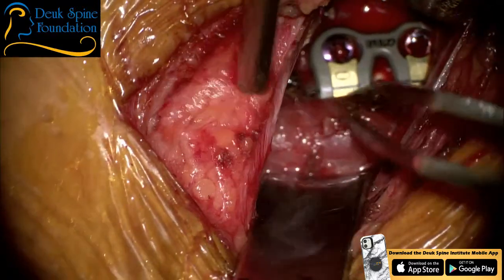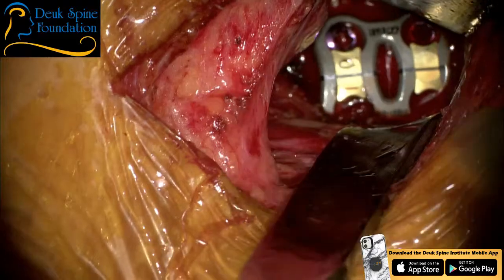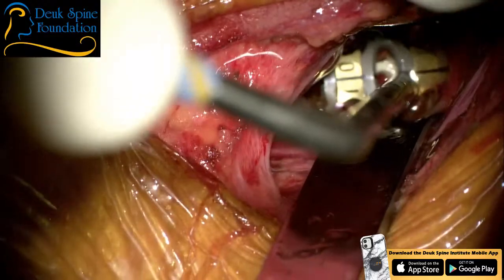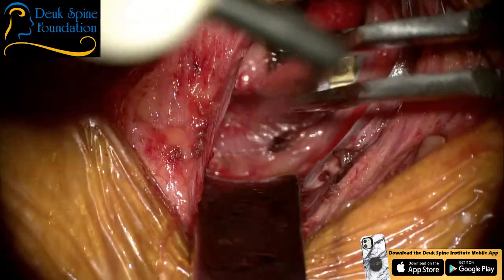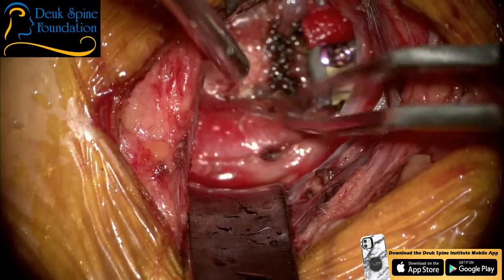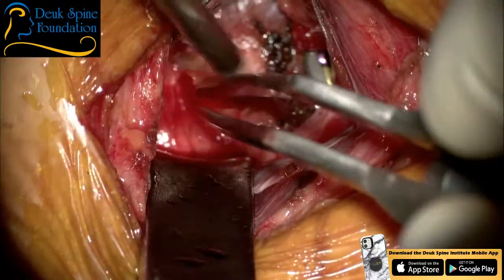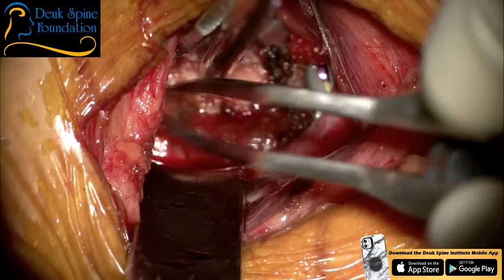He needs to retract. He needs to move the sucker to the other side. He's bumping up against my hand. Okay. Irrigation. Show me where's the rest of the bleeding? Patel, we got to move around till we find it. Suck, suck, suck. Okay. All right, let's start looking around. Let's go north. Slide north. Up here. I need sucking, please. Yep, right up here. I need to see it. You got to move your retractor north. There you go. Suck, please. Right here. Don't push me. In and out. I need to get over here.